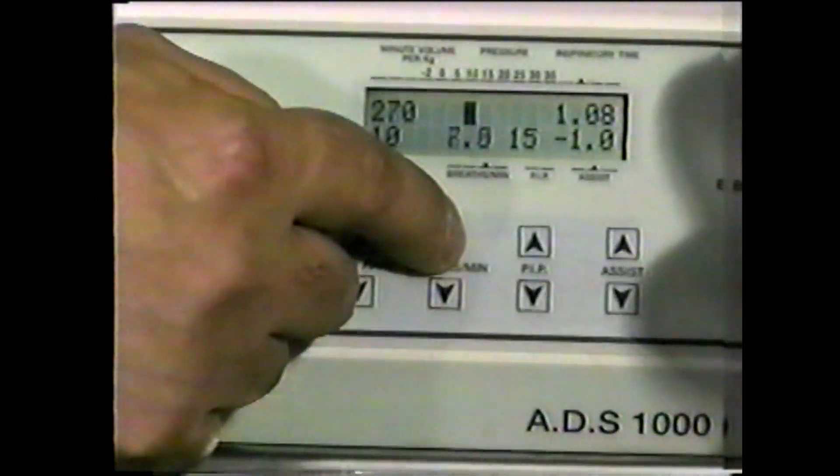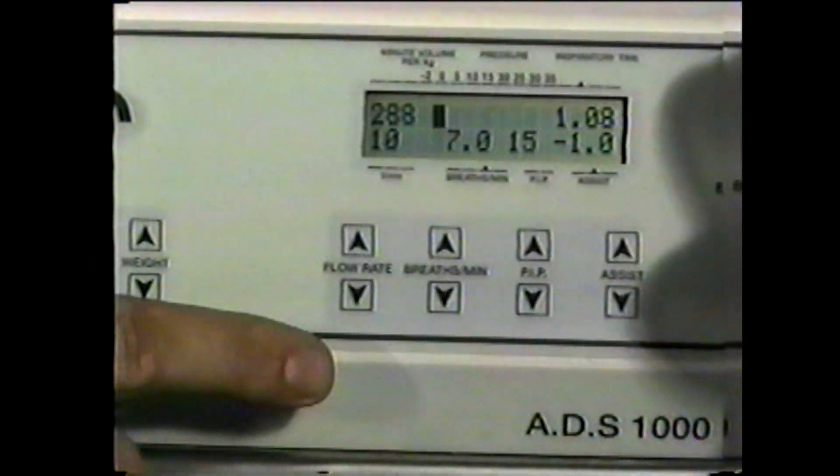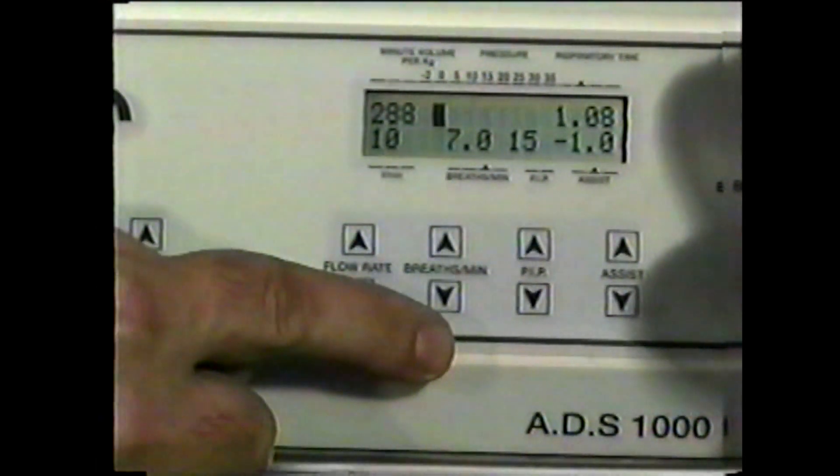These three ventilation parameters will be updated by the ADS computer with each breath. To change the parameters, change the ADS settings. For example, minute volume can be changed by increasing or decreasing the breaths per minute or peak inspiratory pressure.